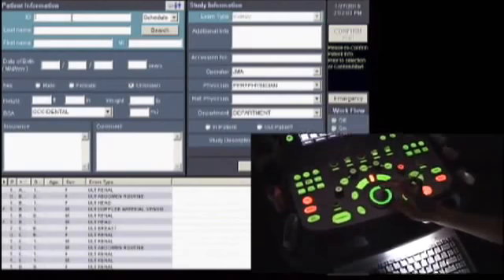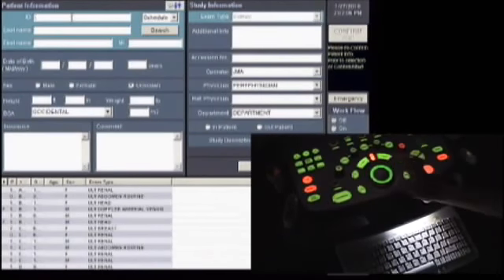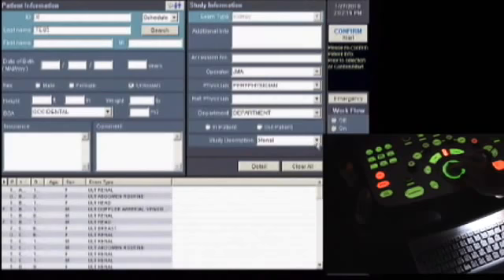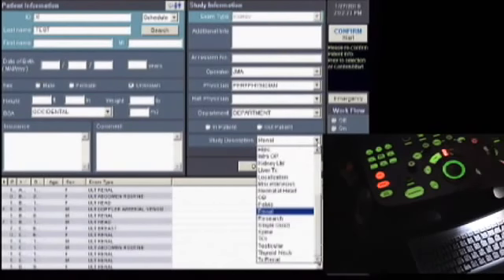Using the trackball, move your cursor over to the ID section, and press set to place your cursor at that location. Enter X for patient ID and 'test' for patient name. Then, to select the study description or preset, we're going to select Renal using this drop-down menu.